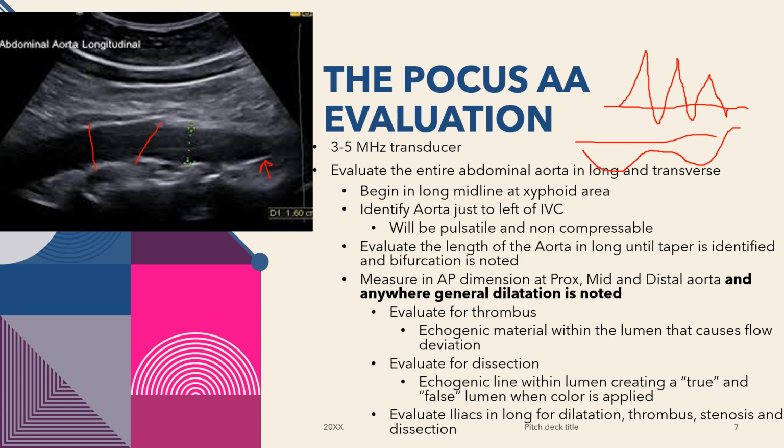So one of the recommendations I make is to make a visual length line, and then make sure that your measurement is perpendicular to that, because it can be tempting to measure at an inaccurate angle, especially when you're starting this, which would have a significant effect on the actual measurement. So just find your line and make sure that you're measuring perpendicular to that, including both vessel walls.